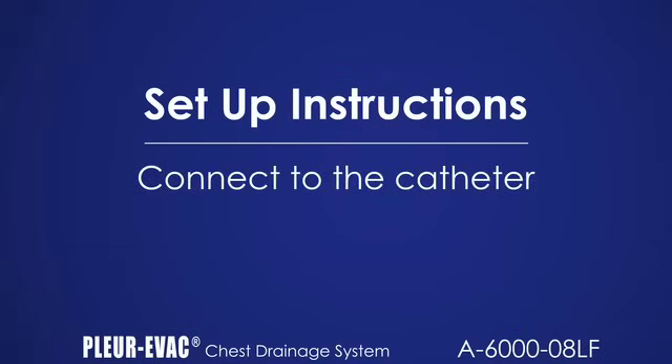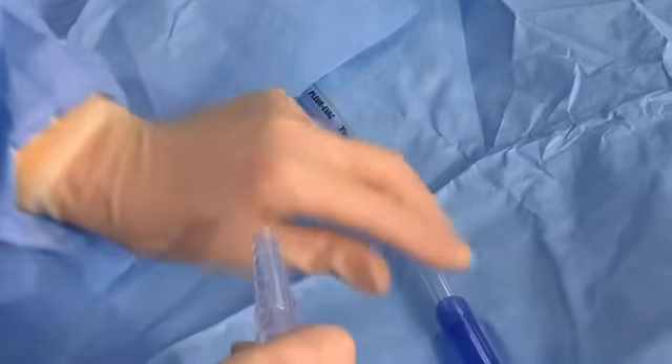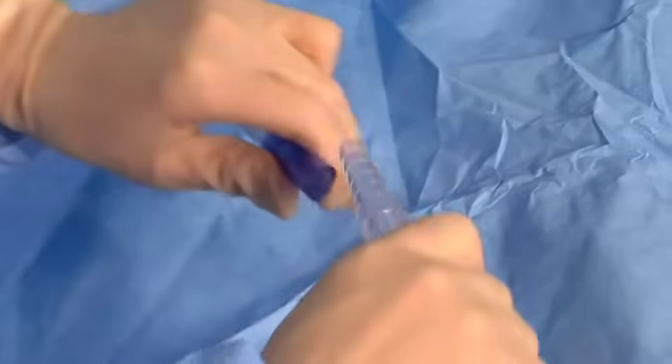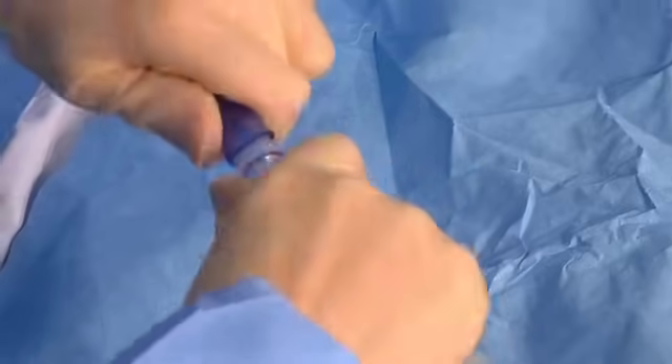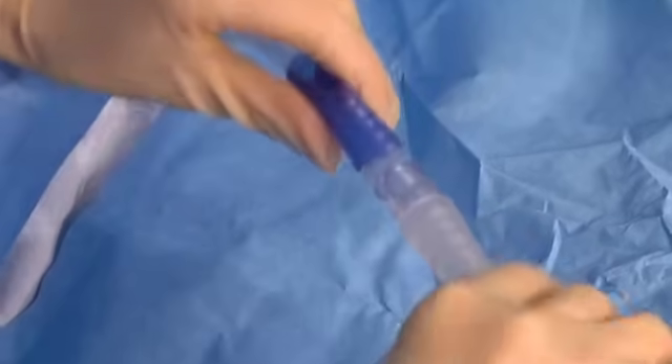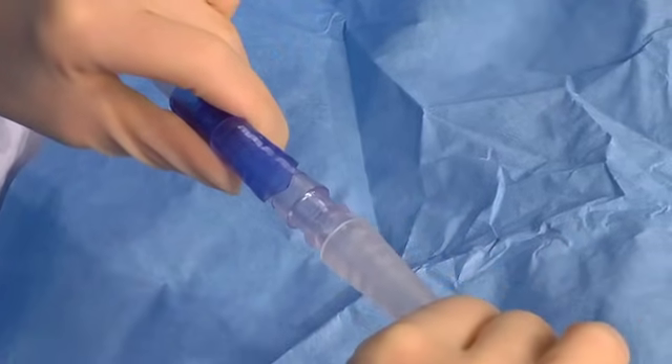Connect the patient tube to the thoracic catheter. Remove and discard the cap on the patient tube, which is present for aseptic technique. Attach the connector at the end of the patient tube to the thoracic catheter, force fitting until secure. Use of tape is optional at hospital discretion.